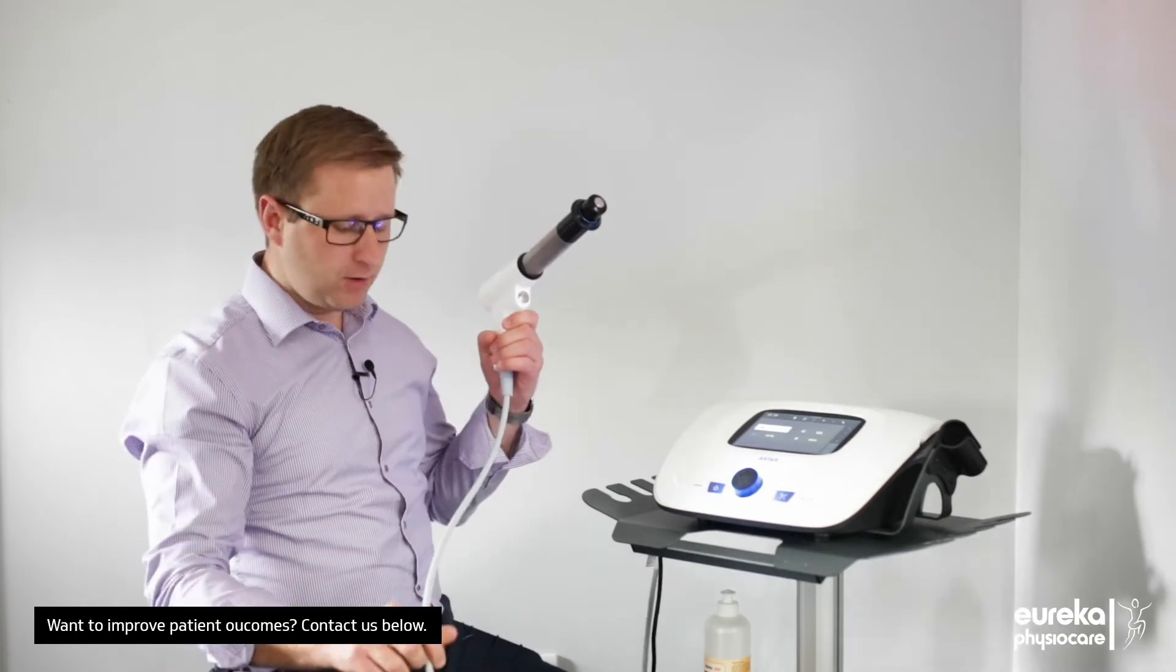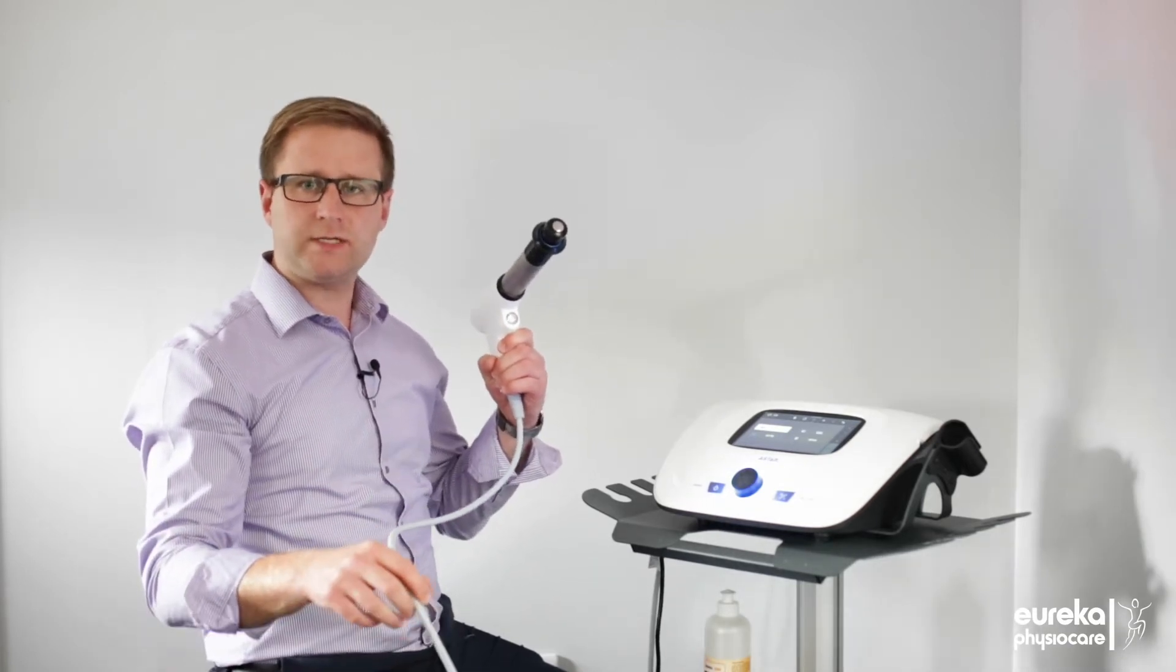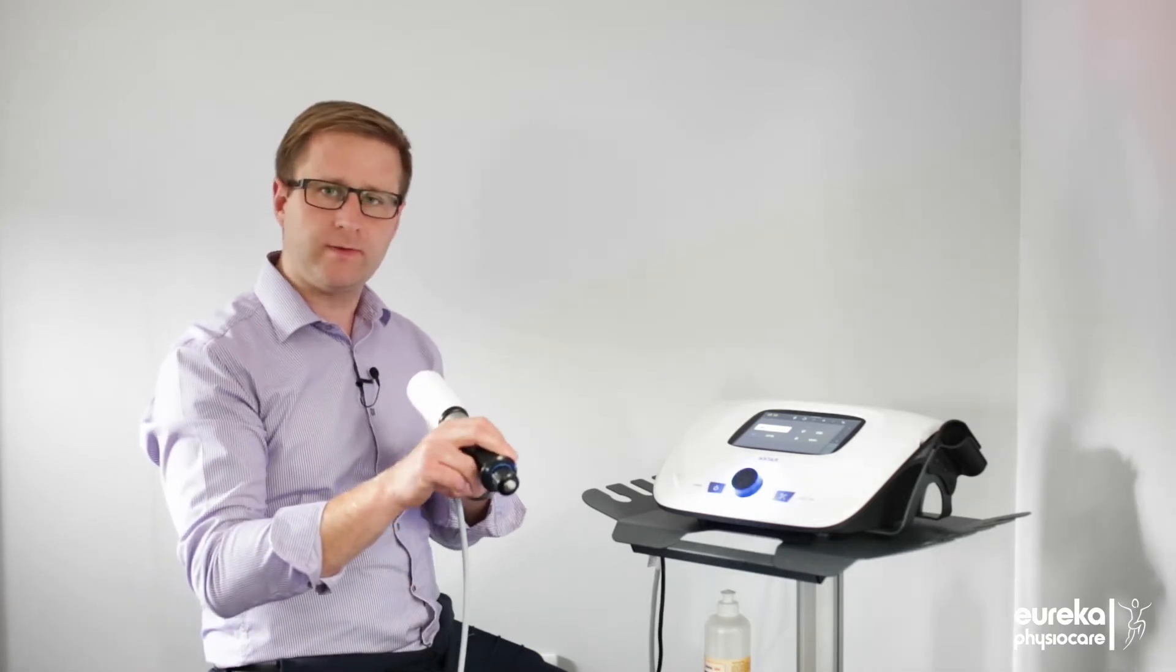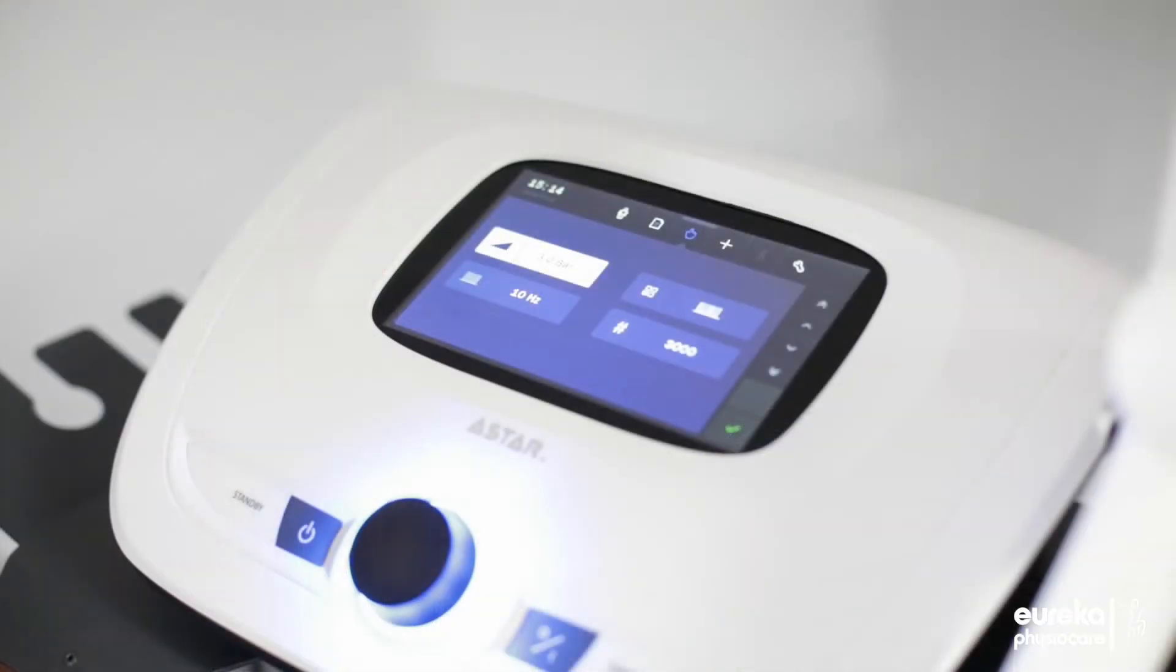The gun also has a very long cord which makes it a very long reach so whichever side of the patient you're wanting to treat or move, it allows you to do that. We have here a very clear seven inch LCD screen which means that it can be very clearly seen around the clinic room and whilst you're treating the patients.